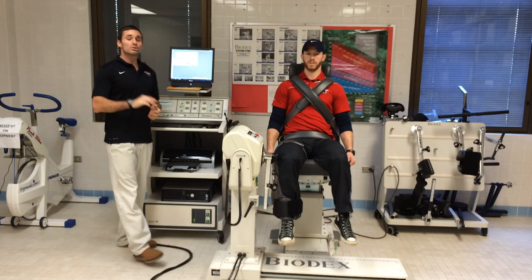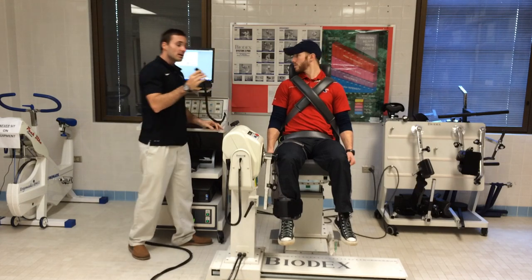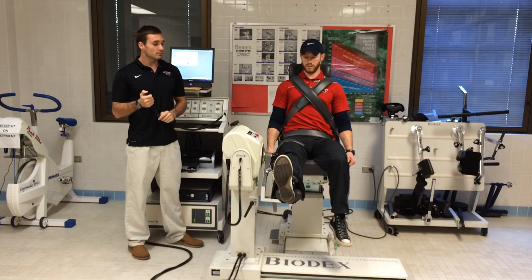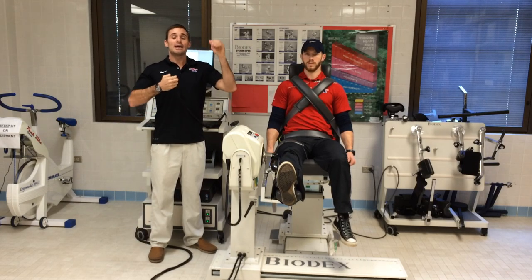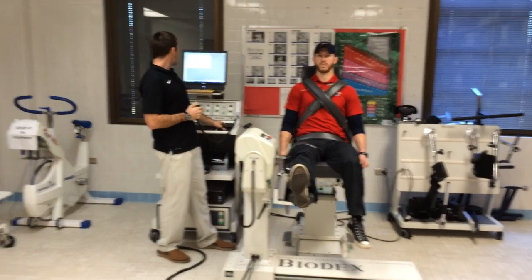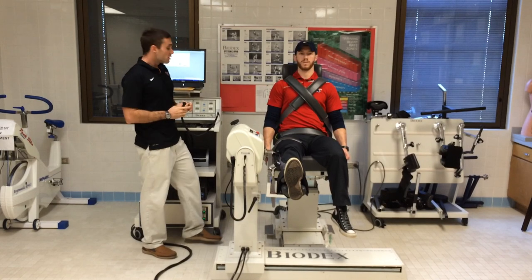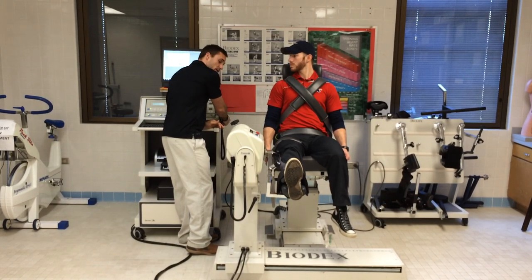The last thing we're going to do is we're going to weigh his leg. So we're going to grab our clicker here one more time. And I'm going to say, Bo, I want you to kick your leg out as far as you can for me and hold it again. And relax. At this point, I want him to take a deep breath in and then relax completely so we can weigh the leg. When he's done that, we're going to hit the scale right here that says limb weight. We're going to weigh it, and now we have his limb. And then when I hit this again, it'll release him.